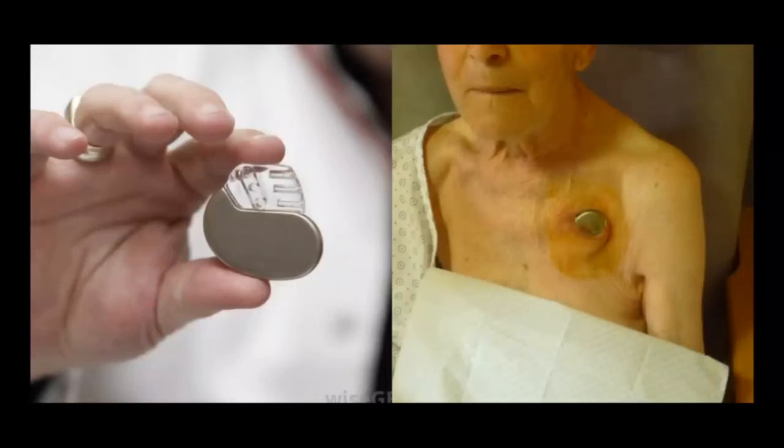Now, before we get into how to observe a patient with a pacemaker implant surgery, first of all, let me show you some pictures of what a pacemaker may look like, and also the site of the pacemaker implant. The left demonstrates what a pacemaker looks like, and the picture on the right demonstrates the site of the implant. Now, without further ado, let's get into the observations of a patient with a pacemaker implant surgery.